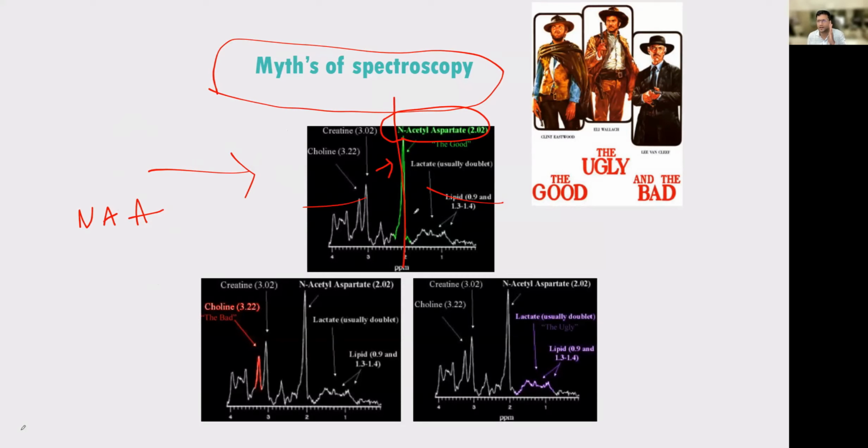And if you have a central good N-acetyl aspartate, that means it is in good health. The brain is in good health. For example, if I give a condition like Alzheimer's disease and I ask a resident what will happen to N-acetyl aspartate, naturally he should say, sir, there will be decrease in N-acetyl aspartate because Alzheimer's disease is a gliotic disease. So automatically there will be loss of a lot of cellularity. So then there will be decrease in NAA in a lot of areas in the brain.